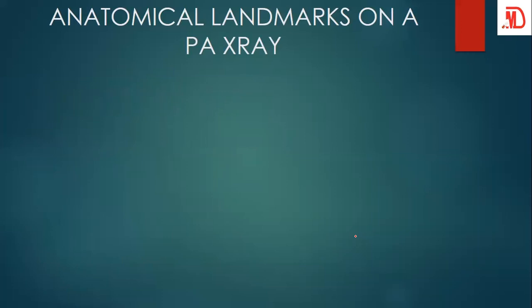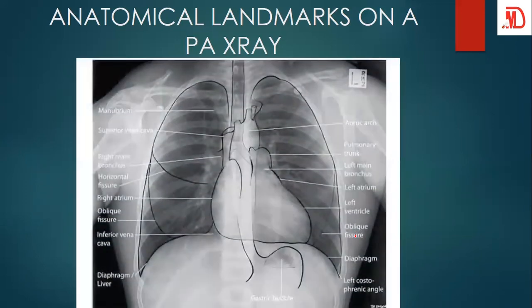Good. So before now, we have understood that the quality is good. The next point is supposed to talk about the reading, right? But before the reading, let's look at some anatomical markings on an X-ray. Just take a minute and look at it.